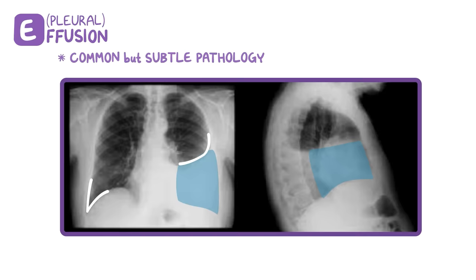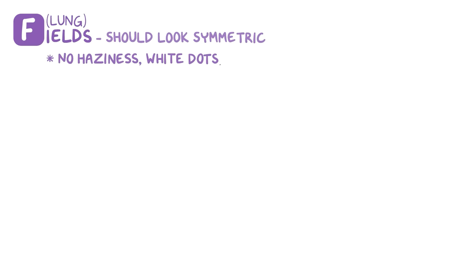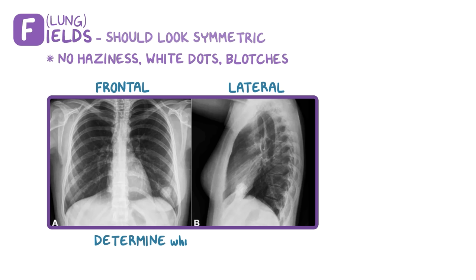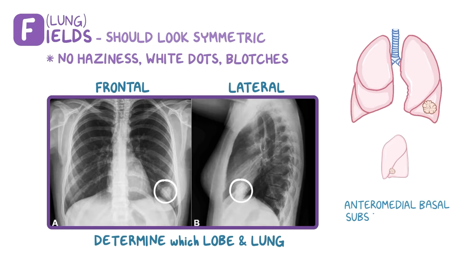F is for lung fields, which should look symmetric. There shouldn't be any haziness, white dots, or blotches. While looking at lung fields, having a frontal and a lateral x-ray allows us to determine in which lobe of which lung an abnormality is located. In this case, a nodular mass is visible in the inferior, lateral, and anterior left lung, meaning it's most likely within the anteromedial basal subsegment of the lower left lobe. This can be confirmed with a chest CT.